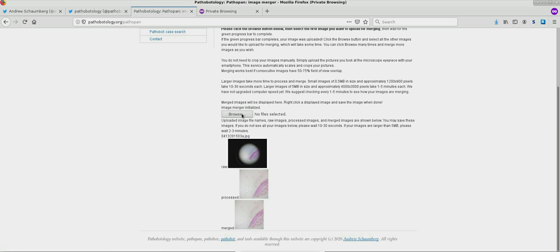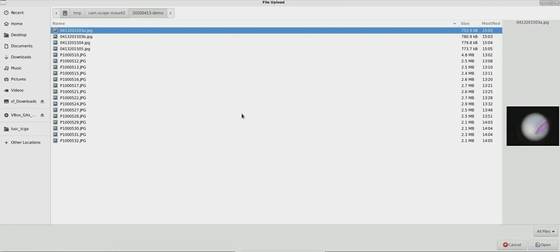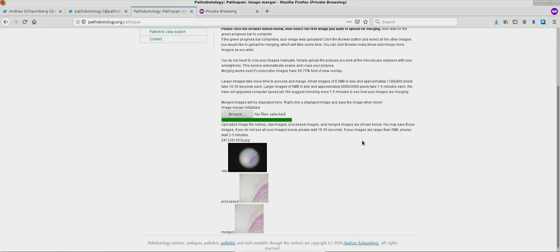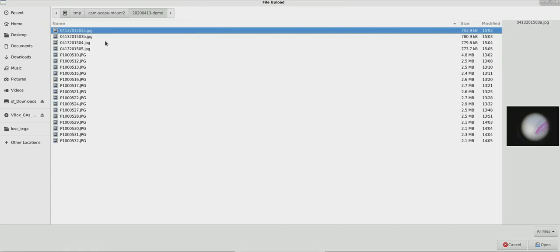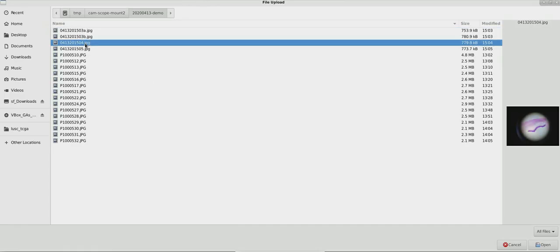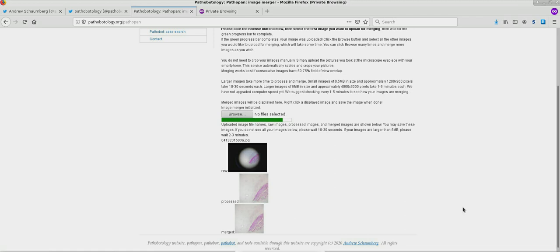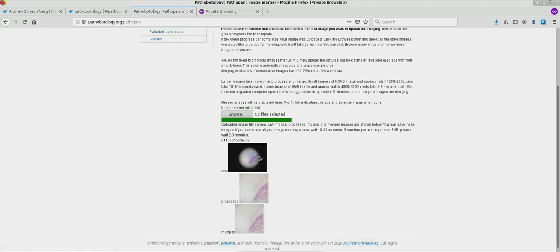So now let's select the second image to merge with this. And again, we see the green progress bar completes. So I'm going to upload a couple more images. Now this is a good time, now that everything's uploaded, to do something else. We will see that each of these images takes about a minute to three minutes to process.